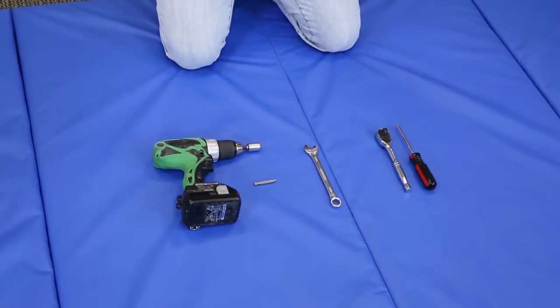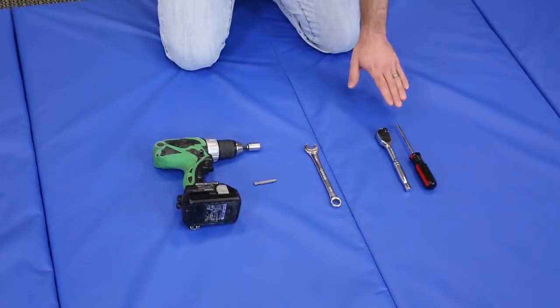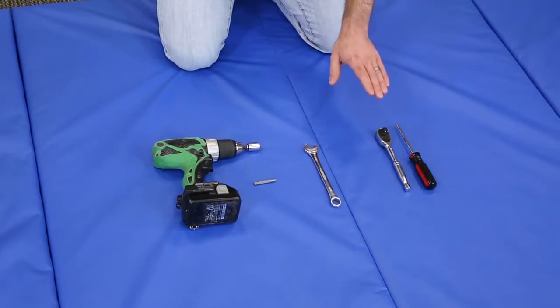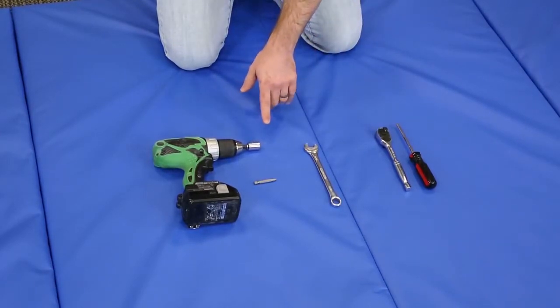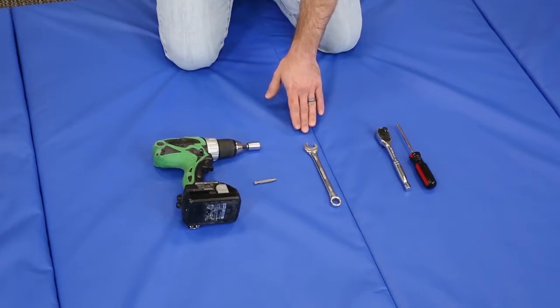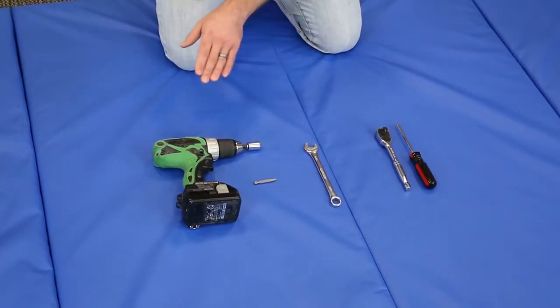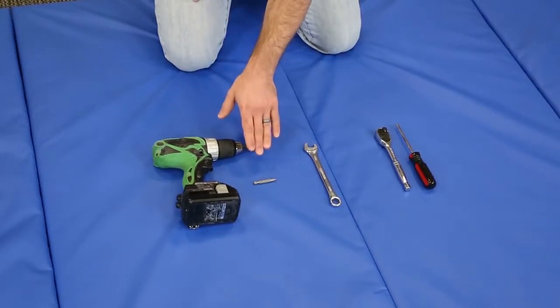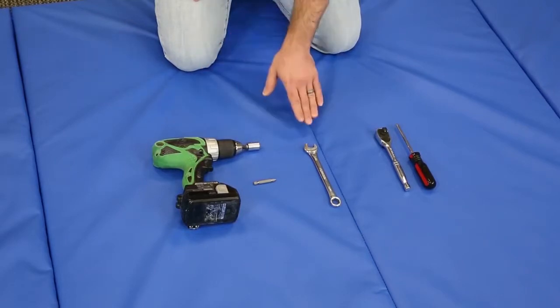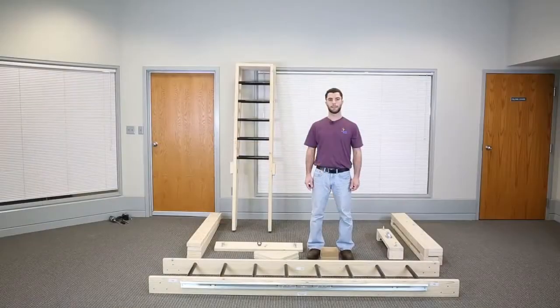If you choose to assemble this manually, you will need a Phillips screwdriver. I recommend a ratchet with a 9/16 socket and a 9/16 wrench. However, for speed, and in this video, I will be assembling with a power drill with a 9/16 socket and a Phillips bit for my power drill, as well as the 9/16 wrench.